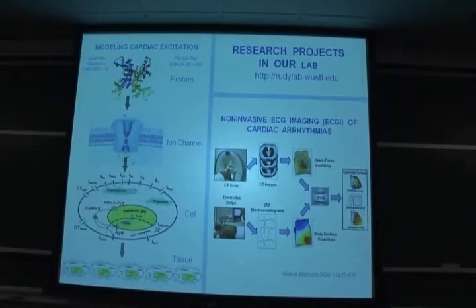In parallel, we've been for many years now developing a novel non-invasive imaging modality for the electrical activity of the heart. So here we simulate and try to understand mechanisms in models based mostly on animal experiments. And here we try to image and study the mechanisms of these arrhythmias and their presentation in humans in a non-invasive fashion. So I'll focus on this part today.